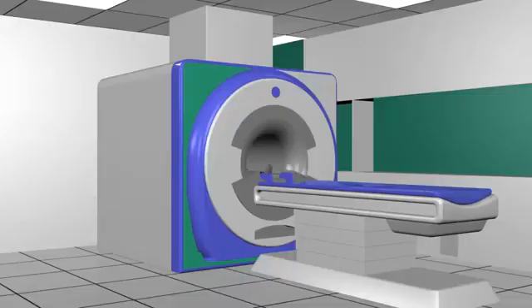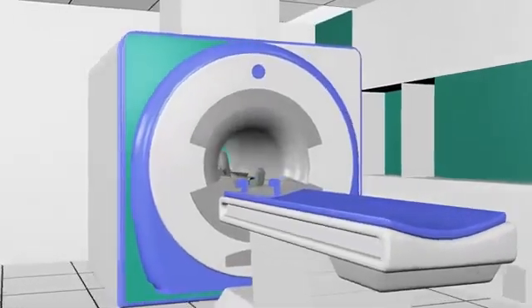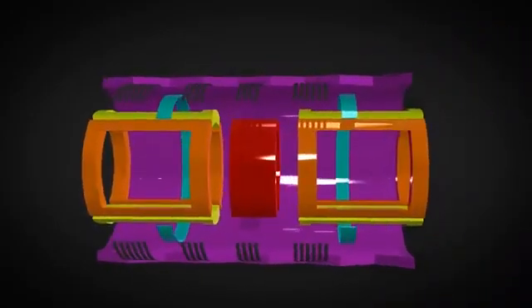Magnetic resonance imaging is an imaging technique used in medical settings to produce high quality images of the inside of the human body. The MRI scanner consists of a 24-inch tube, inside which the examination takes place. It is made up of 4 components. The magnet is the most important part and the biggest component of the whole scanner.